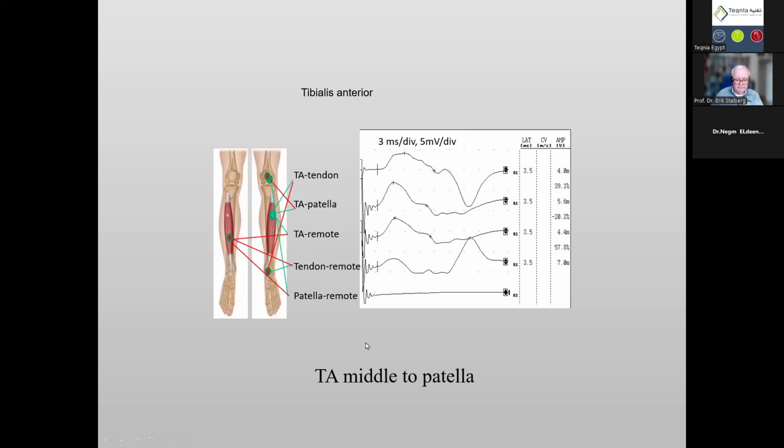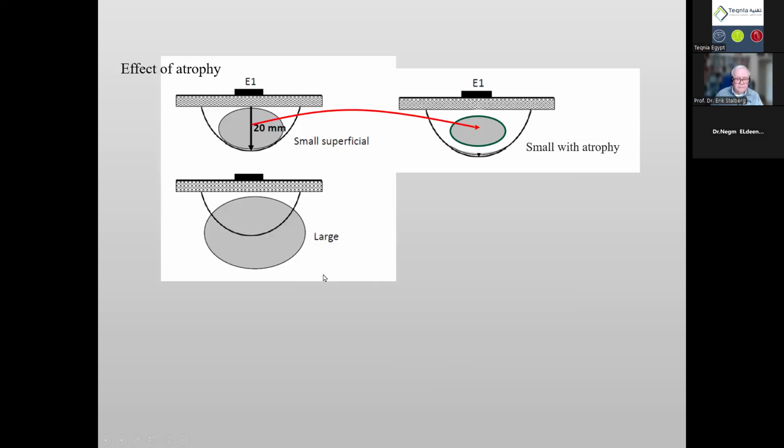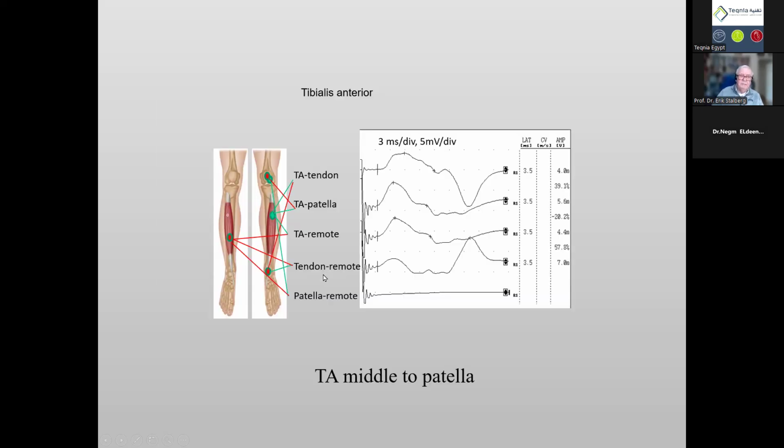And the same thing for the biceps, for example. It should not be at the tendon, but it should be up to the acromion.